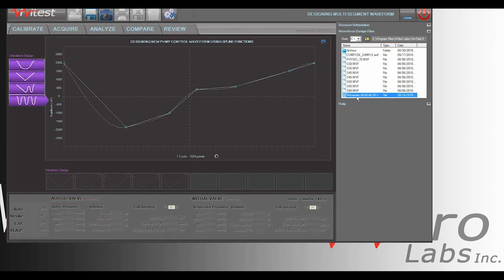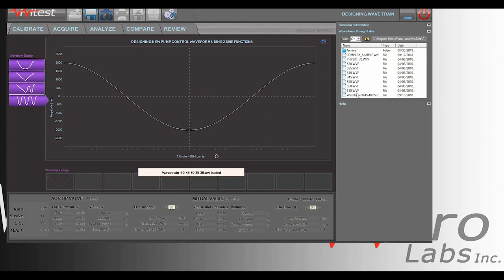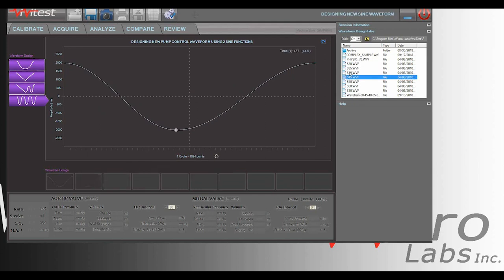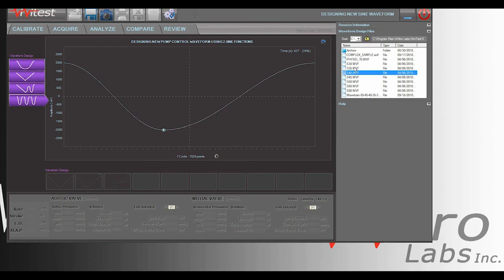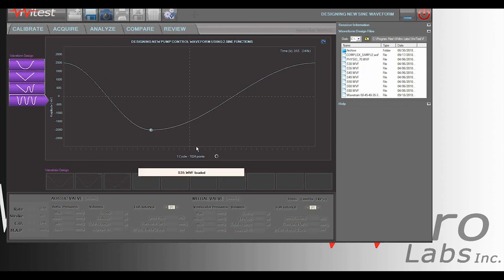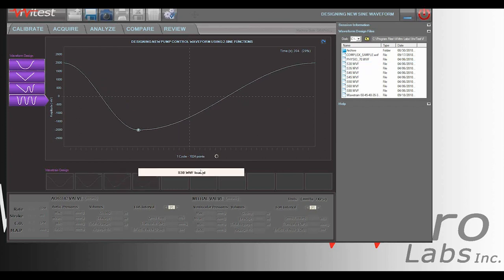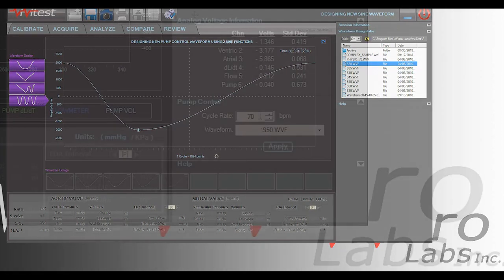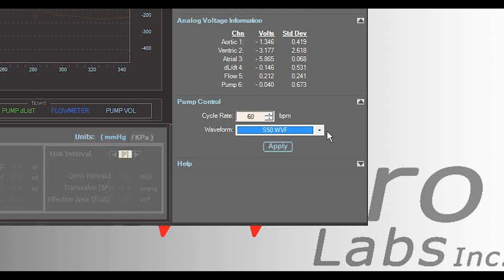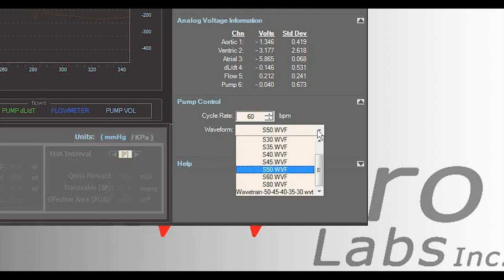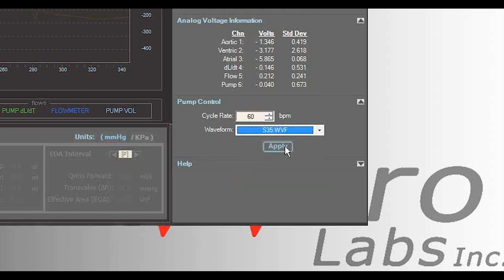Vivitest software also includes custom waveform creation tools to easily develop complex waveforms and wavetrains. Wavetrains stitch together different waveform files to simulate conditions such as arrhythmia. Waveforms created in Vivitest can be selected and used to drive the super pump directly from the Vivitest user interface.